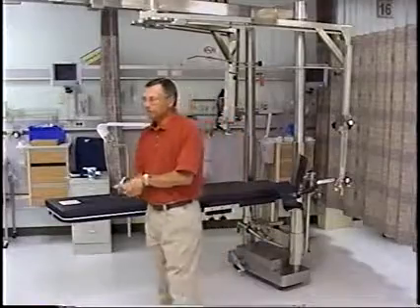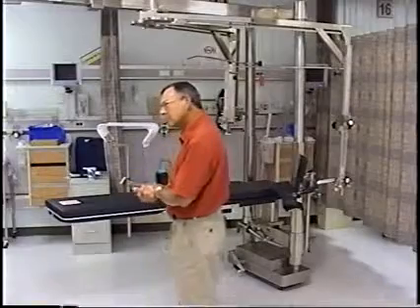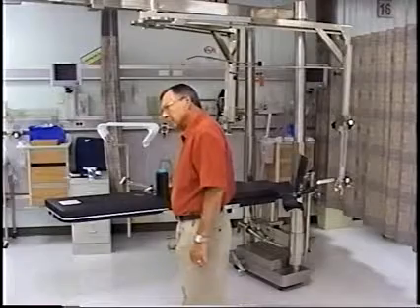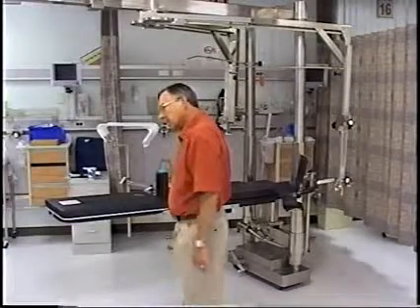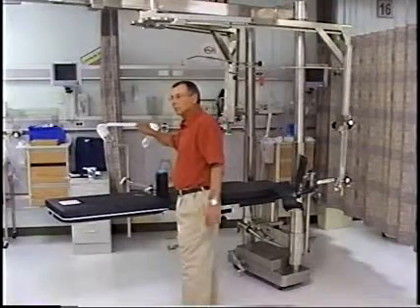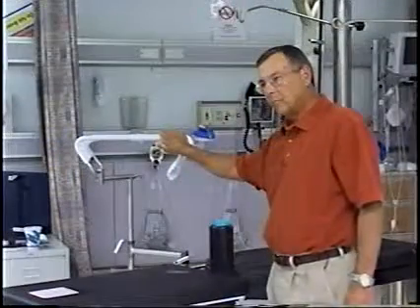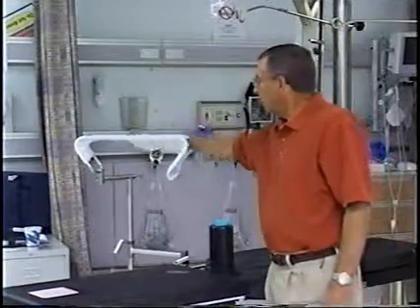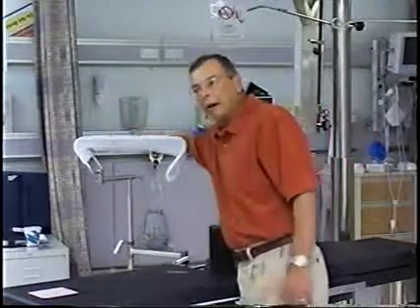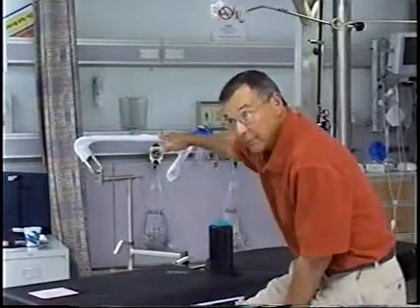Okay, any questions? All right, yes? I had a statement along with the nursing aspect of it. We usually use the 4-inch stockinette to wrap the well leg holder because the 6-inch doesn't really give the leg enough support. Yeah. I've seen a lot of hospitals that will put this on, and then they'll put a gel pad over it, just to pad it, especially around that popliteal area.